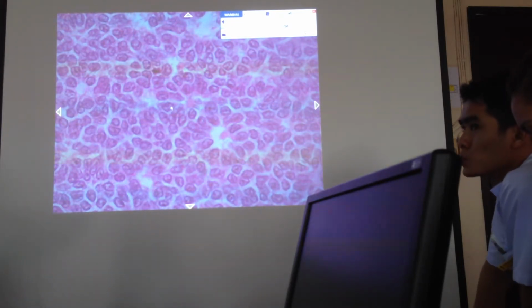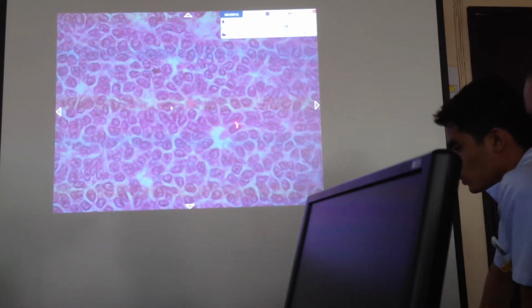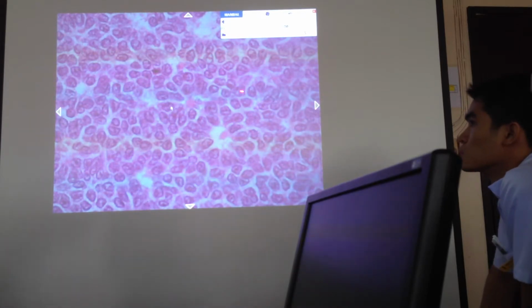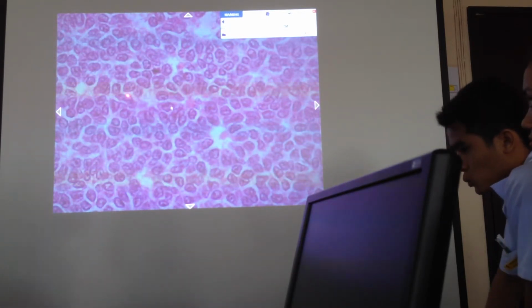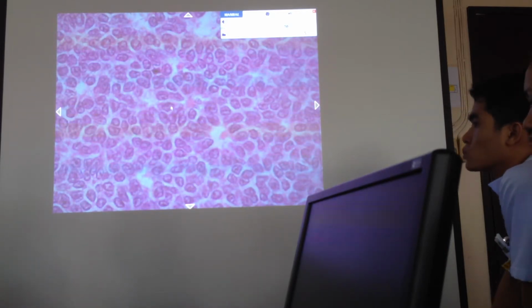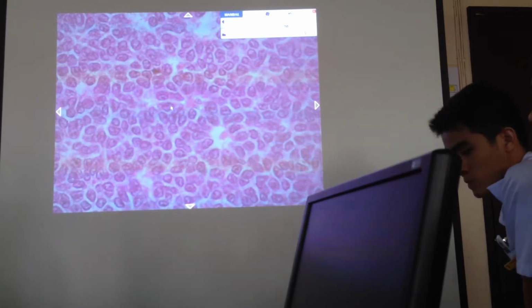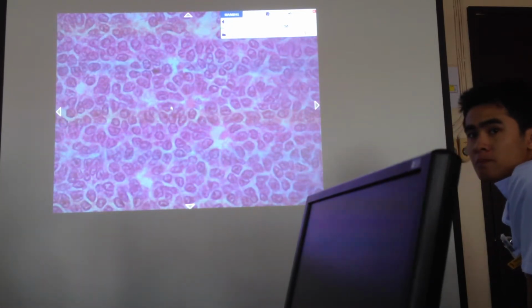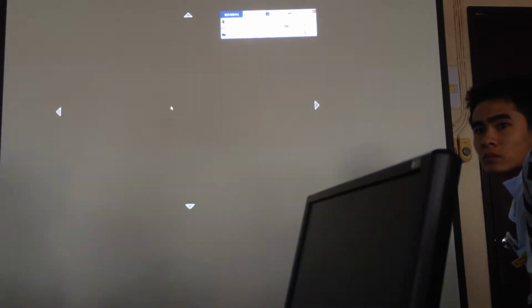Kasi minsan we would have a problem if there's absence of Call-Exner bodies. So when we look into the individual cell, if we see vesicular nuclei with grooves, okay, showing coffee bean appearance, okay, para siyang coffee bean, nakita na kayong coffee bean, may ano sa gitna, okay, so that's a granulosa cell.